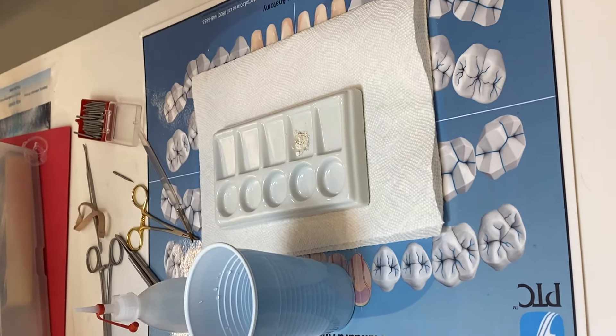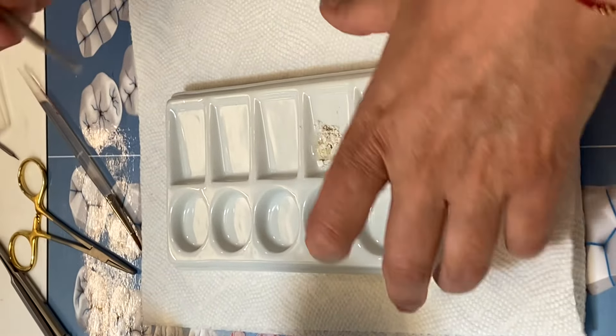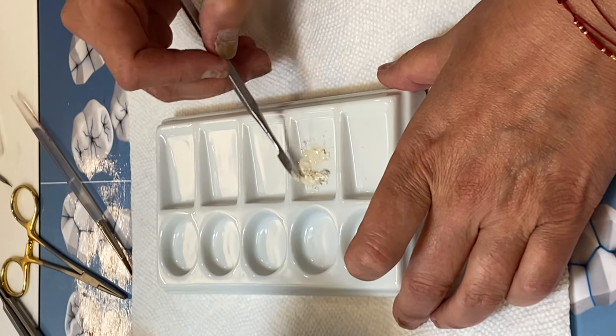When we put the liquid, first don't put too much, and then mix it — mix the powder with the liquid to form like a loose paste.